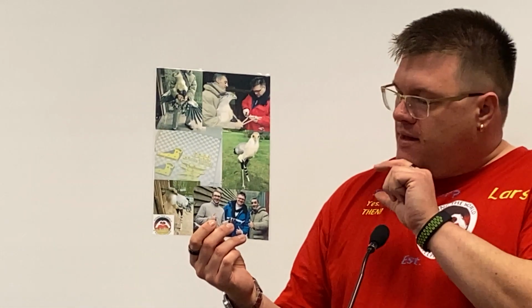Sorry, I have no presentation. But the bird, let's say like this, the bird keepers came up with the idea, you know, this bird is missing 8 centimeters of leg, and they wanted to have an additional feet, but I could not make a feet like this, fixed totally on the leg, because it should move, otherwise it would walk funny. But the bird has one extra, and that was funny because he can step on his prey with 5 times his weight. So I come with the idea, actually the whole thing is long like this.